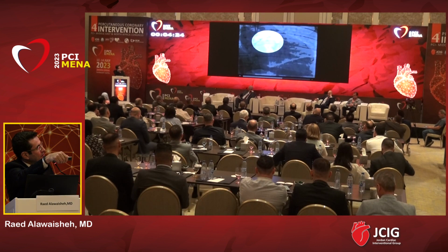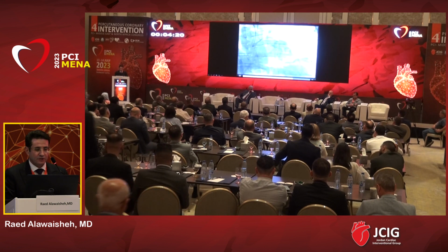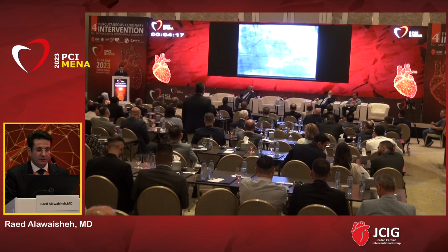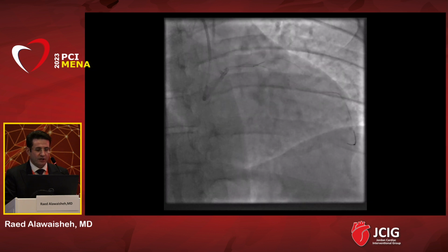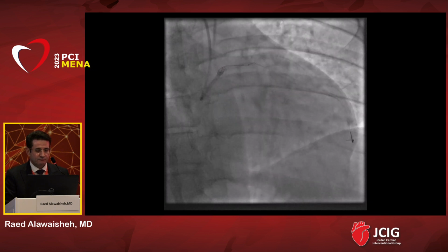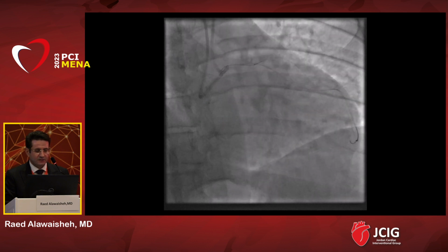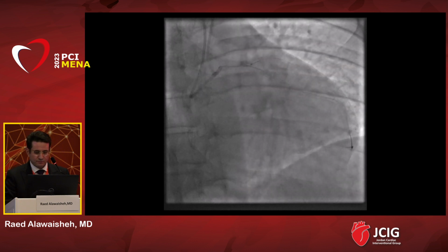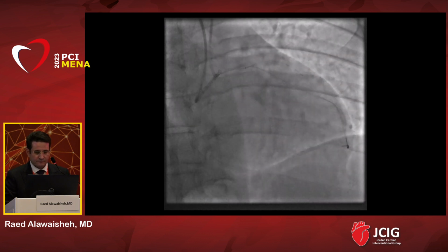If you concentrate there, you go with the wire and try to get the wire inside the guide. So this will be your retrograde direction. And as you can see here, successfully the wire went. Trying again here, supported by the microcatheter, changed the direction, and taking this view, you can see now the wire still is not getting in. No, this one actually shows it very well.